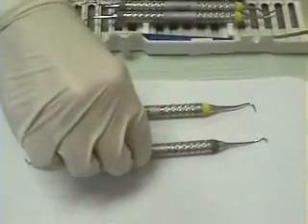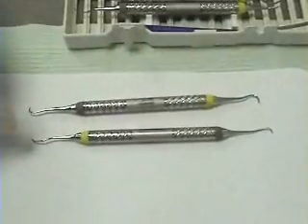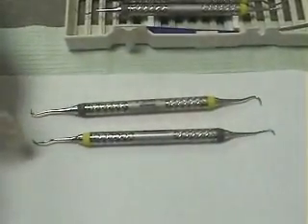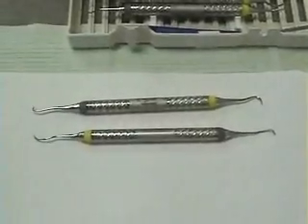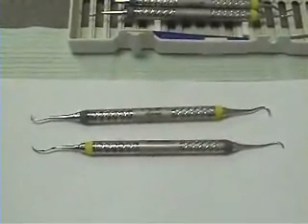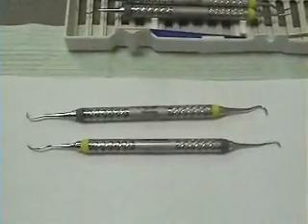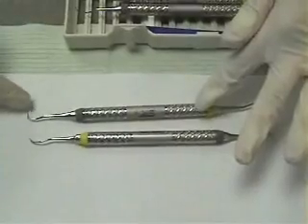The next instrument is the modified sickle, which has mirrored ends offset at a 90-degree angle. The extra bends in the shank make it accessible in the posterior and the proximal. On each of these instruments there are two cutting edges on each side.